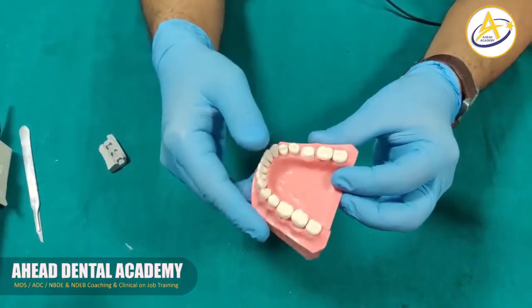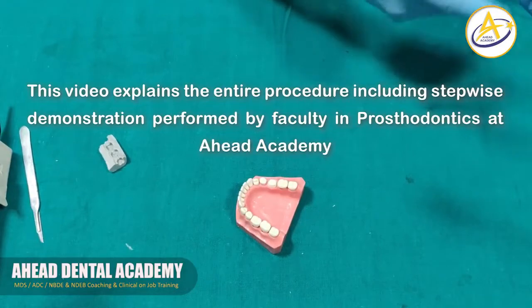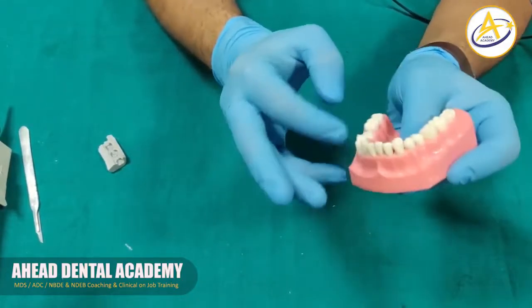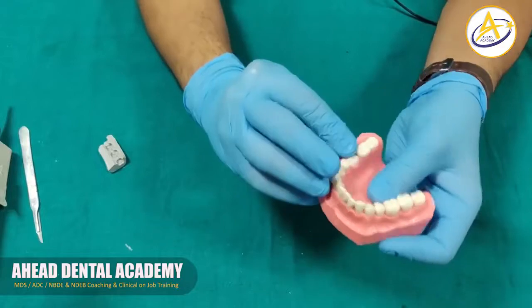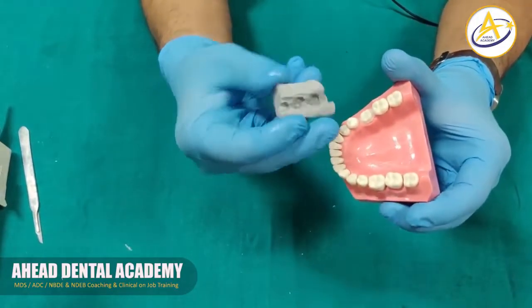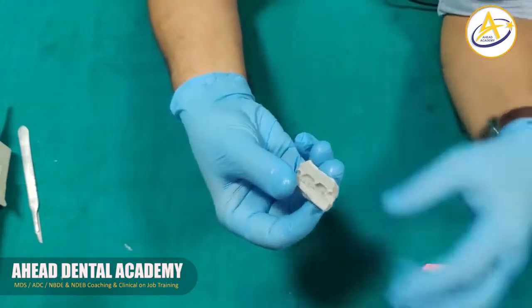Now for demonstration purposes, we have already achieved tooth preparation on this tooth that we had taken an index of. So we apply a small amount of separating medium, usually Vaseline, around this tooth and the adjacent teeth, so that our temporary material does not stick with the tooth. After that, we once again confirm that our putty index is seating over the tooth.